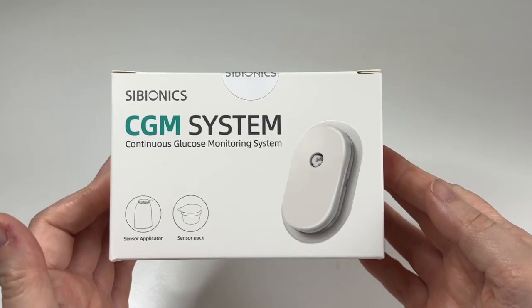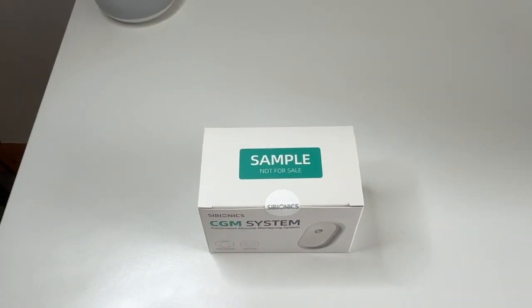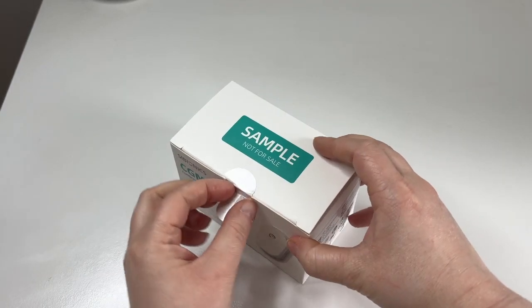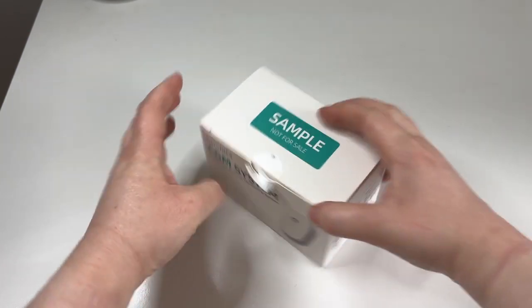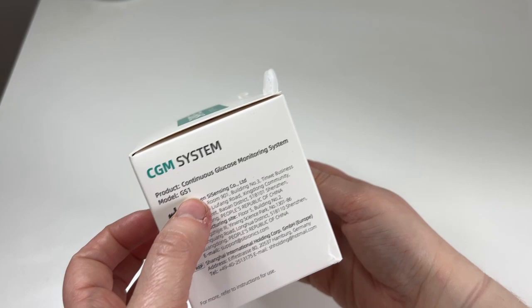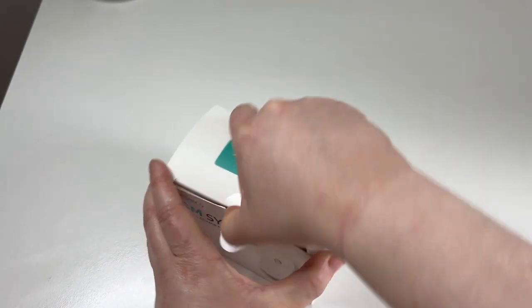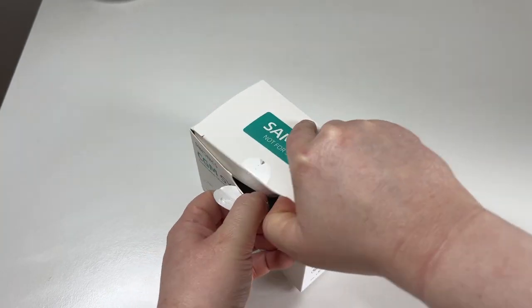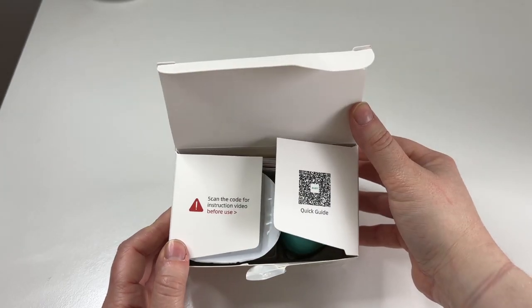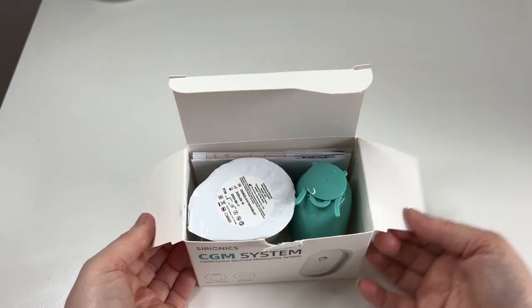Look how pretty this looks. Let's go ahead and open this up and see what we have here. So like I said this was gifted by Sibionics. I've been doing a bit of reading online and they sent me some info in the email too. This company Sibionics was set up in 2015, but at the end of 2023 they just got CE mark approval in Europe for this GS1 CGM system. That's why you're probably seeing it on your YouTube and Instagram now.